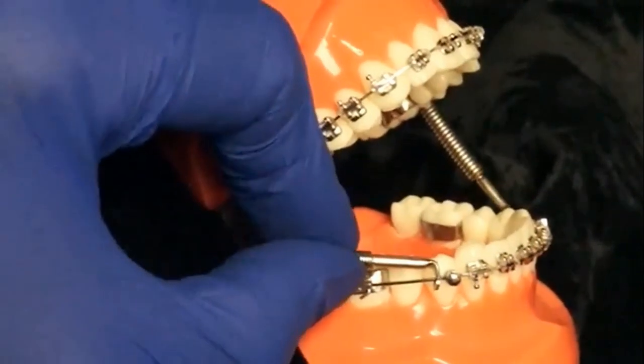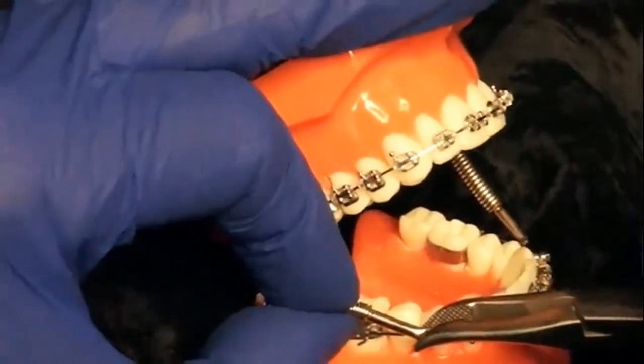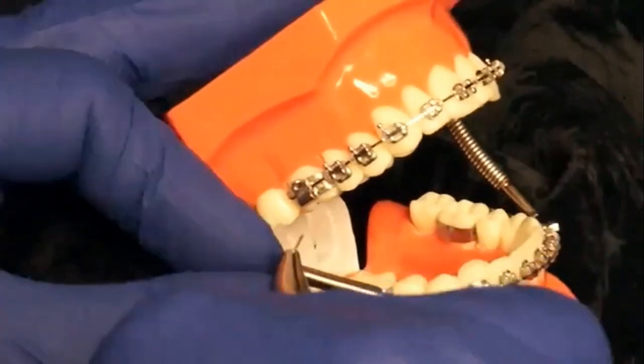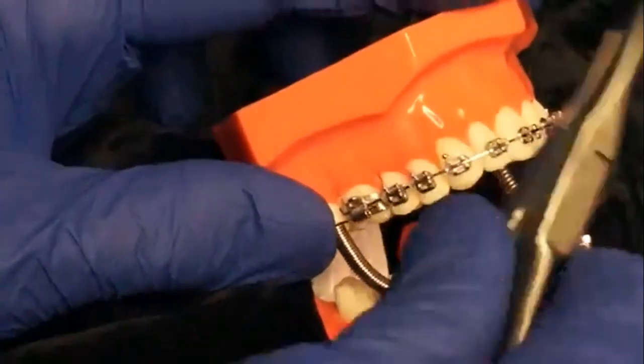So we fix it on both the sides, we hook it on, and there is a ball there in the canine region. We are going to bend it so that it does not come out of the wire. I'm attaching it on the wire, and on the other side on the maxillary molar tube we insert, and then we are going to cinch. We are going to bend the wire so that it doesn't come out.